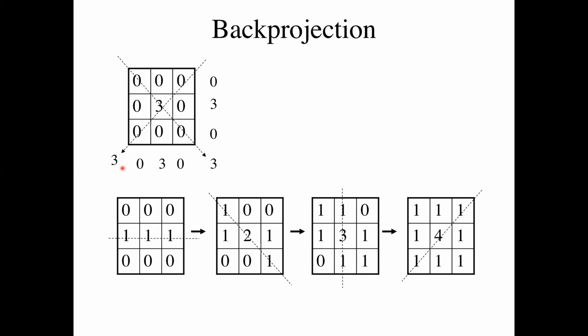And so that's called iterative reconstruction. It's computationally time-consuming, but you can get very close to the real answer by doing that. That's a really good point. This is like naive back projection. Okay.